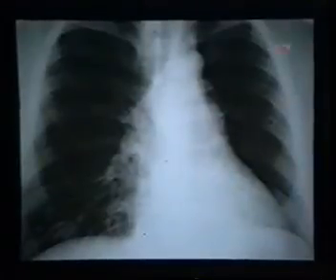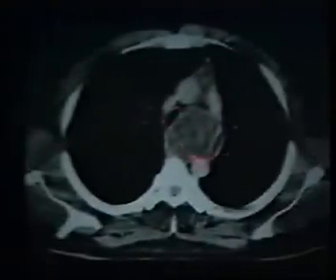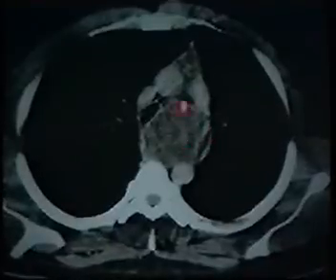Why do these patients sometimes present symptomatic? Here's a patient who clearly has decreased perfusion throughout the left lung. There is a mass, which I think is best seen on the CT scan, and it has a fluid density, just at about the point of the AP window. It's clearly compressing the trachea. And the end result of that is that the left mainstem bronchus is really quite narrowed. We see it just as a slit here. There is some inflation, but you can see it's markedly decreased.